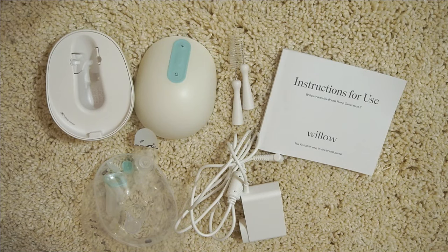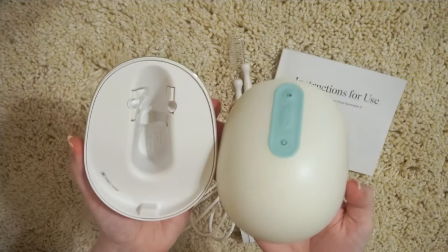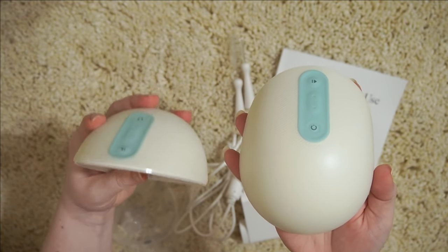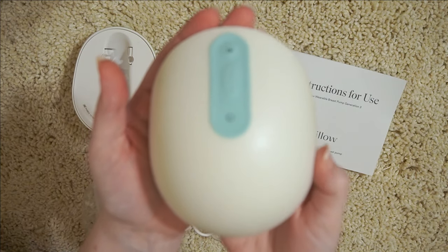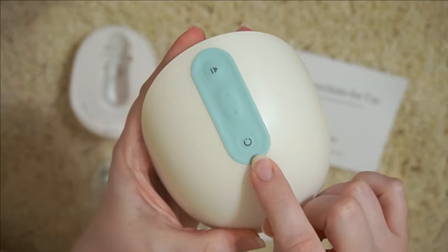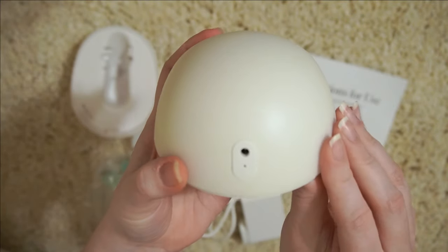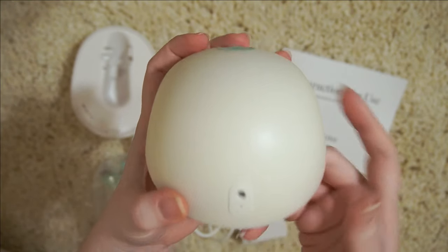So this is a look at what comes with your pump. Obviously you have the motors — I have one flipped over so you can see the inside and the outside, but they are identical. This side is where you will place your flange and it will attach to you on your breast. The outside has a few buttons: the power button, decrease suction, increase suction, and up here is either start or pause. All the way down at the bottom, each side also has a power port — that's where you will charge them.